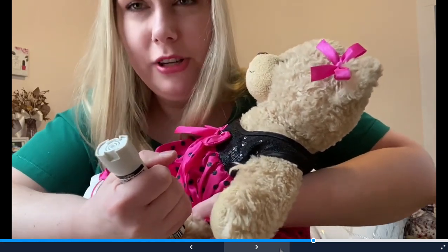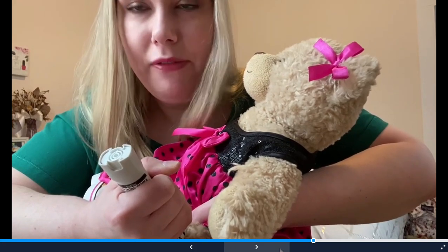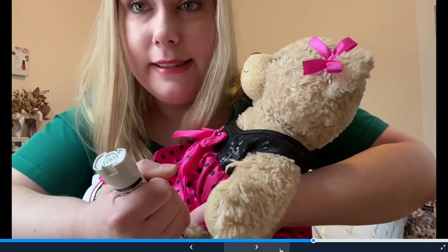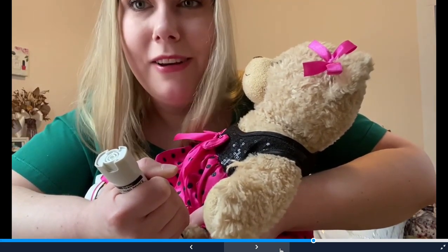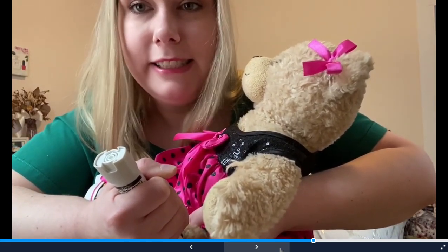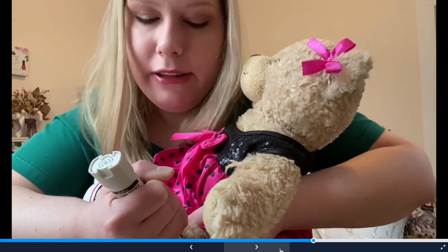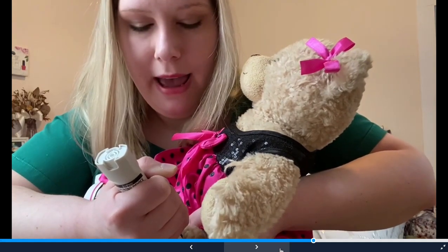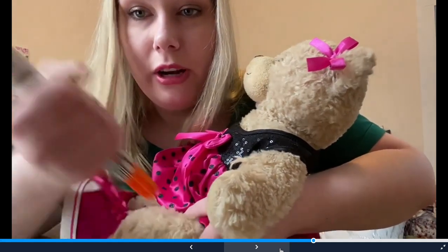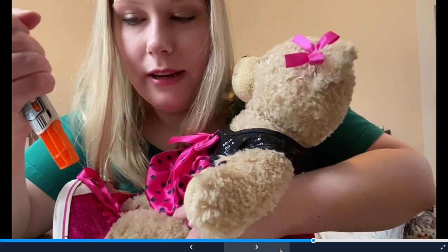You're gonna push until you feel and hear a click. After you hear the click, you're gonna count to 10 seconds. So we're gonna go 1, 2, 3, 4, 5, 6, 7, 8, 9, 10. Counting out loud will help you remember how many seconds you are at. After the 10 seconds are over, you're going to release the EpiPen away from your friend's leg.